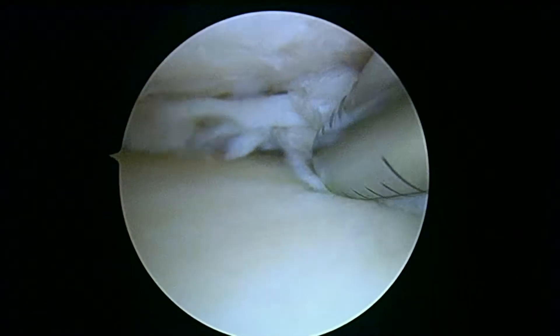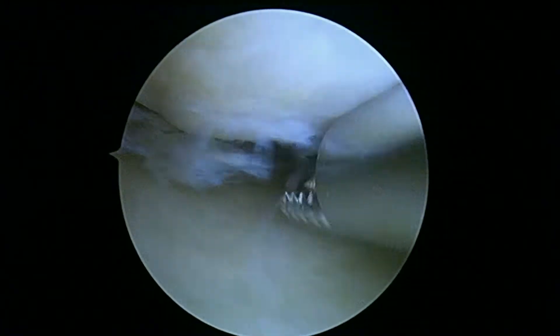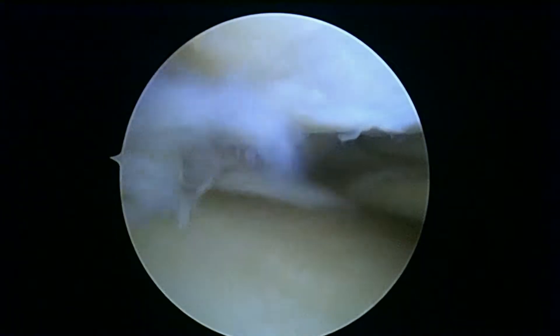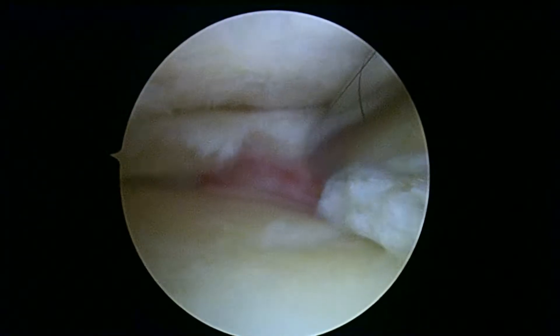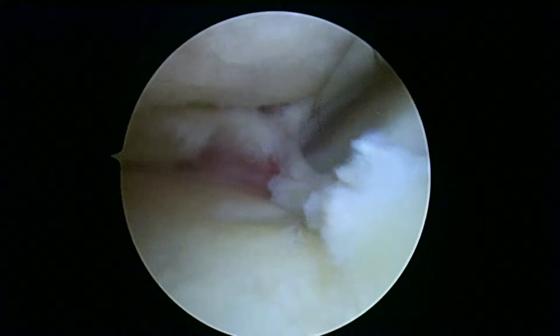Okay, it's Dr. Buford. We're just getting started on the right knee. We're looking in the medial compartment and we can see this meniscus is not in great shape. We're going to start with our shaver because it has suction attached to it, and this will allow us to pretty easily remove the really loose parts of the meniscus. We're probably going to need a slightly curved-up pair of scissors or meniscal biters in just a minute.